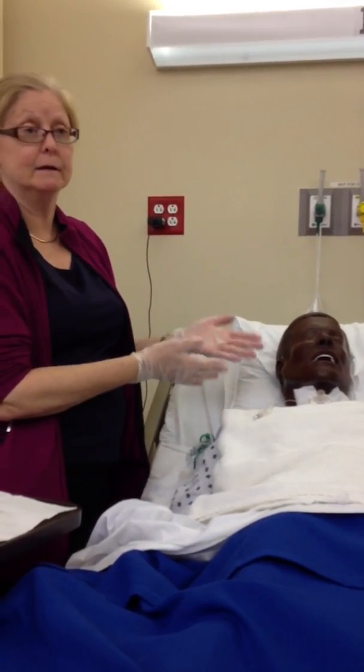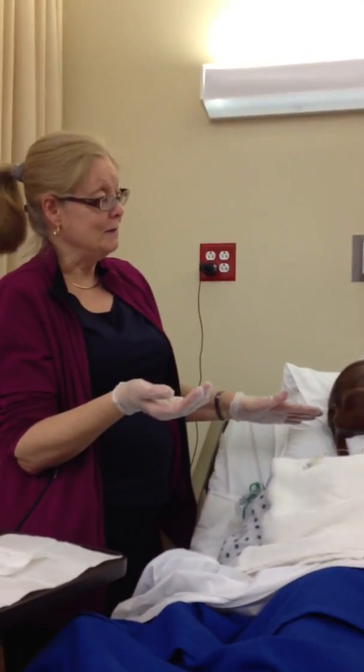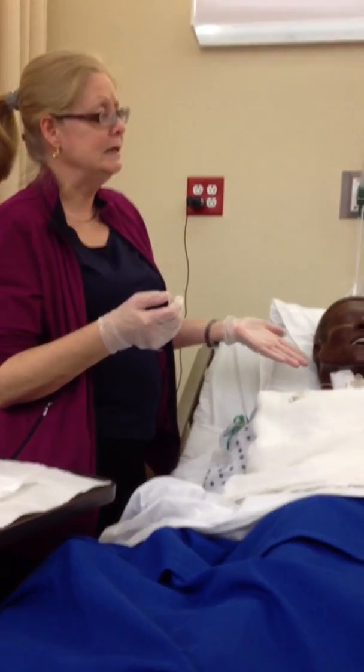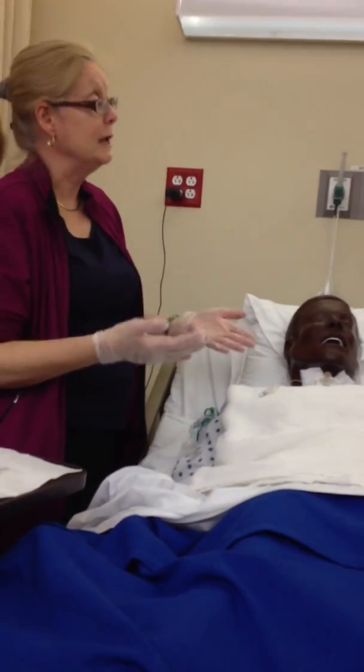Right, and remember, guys, this is the mannequin. He's not gonna be turning blue on you or anything. So you know, you're right. Every person's gonna be a little bit different. Some people are gonna be more challenging than others. What you can do, you can maybe let their head down just a little bit if they can tolerate it. Most people that have airway disease can't tolerate being down very flat. So you just have to kind of work around the best you can.